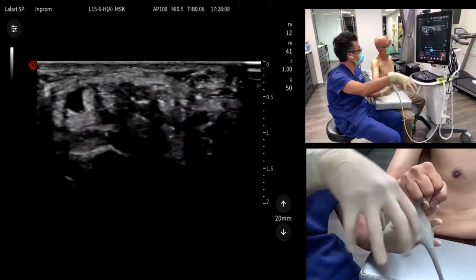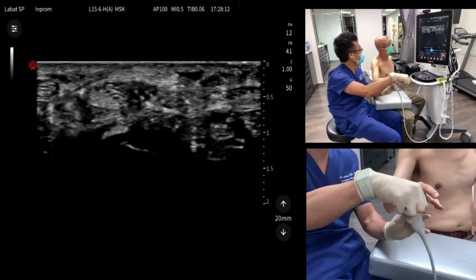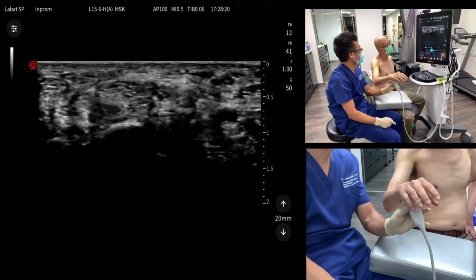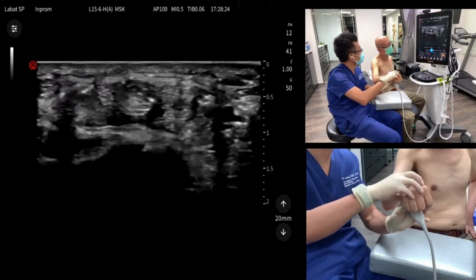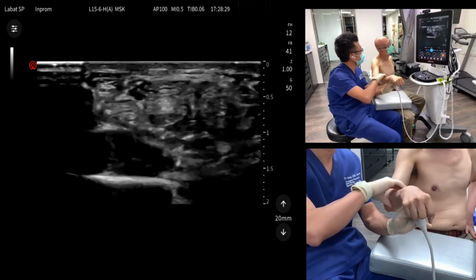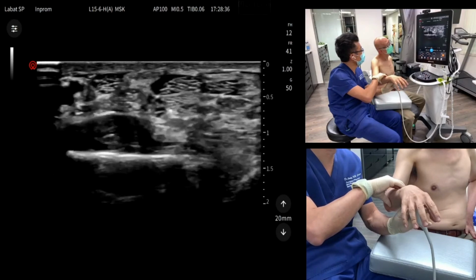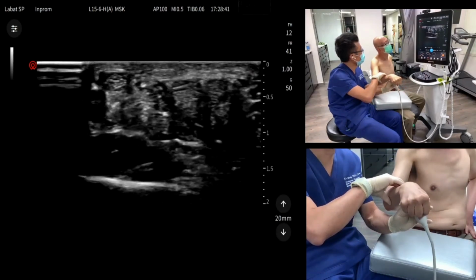So if you're holding something like this, and then you do this holding the fist, your median nerve is going to be squeezed by the flexor pollicis longus and flexor digitorum tendons. So that is not good. So this time let's do that again, and then flex the wrist, squeeze again, and relax, and squeeze again. This time it's okay. Oh, relax again. Oh, now it's squeeze again. Then your median nerve does not like.